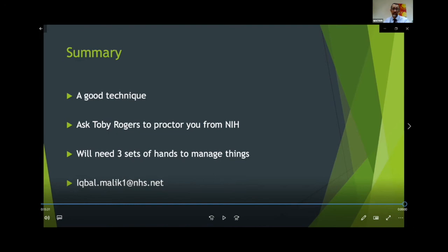I must say, we use a lot of axillary now as our second access, and percutaneous axillary is also good. But in those where you can't do that, or you want to develop this as the sole other technique, I think it's very reasonable. We screen all our patients to say if this can be done. I would say that we find that probably 30–40% might be suitable for this. There's usually something badly wrong with the aorta, or the space is too far away in the 70% that we can't do it. Thanks very much.